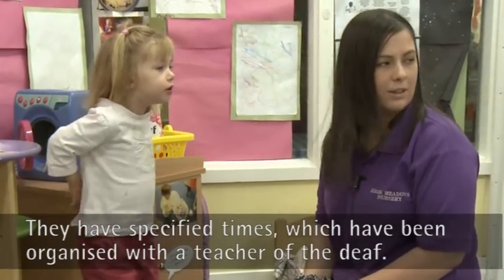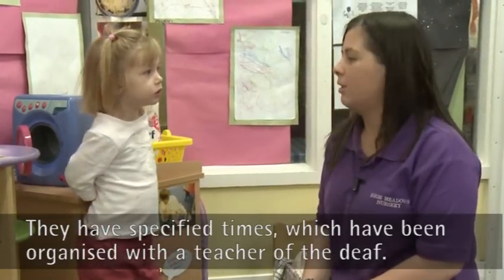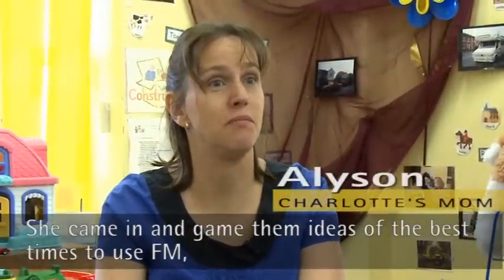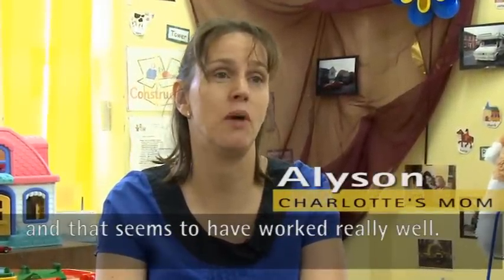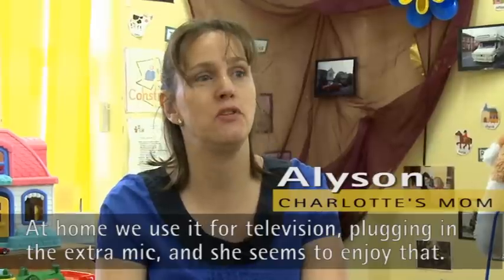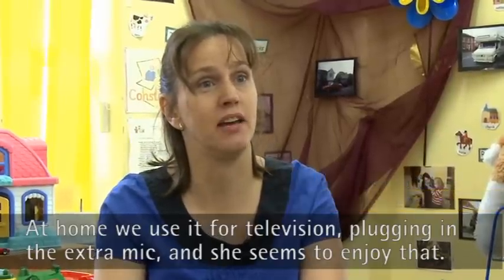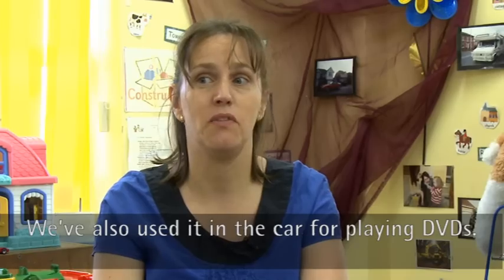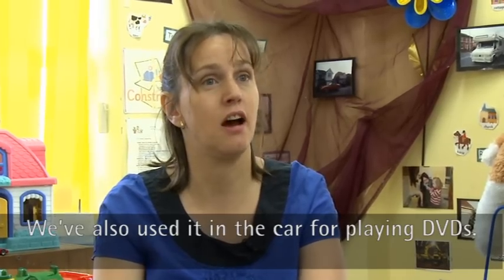They do have more specified times, which has been done with the teacher of the deaf. She came in and gave them more ideas of when will be the best time to use the FM, and that seems to have worked really well. At home we use it for the television, plug in the extra mic and use it with the television, and she seems to enjoy that.